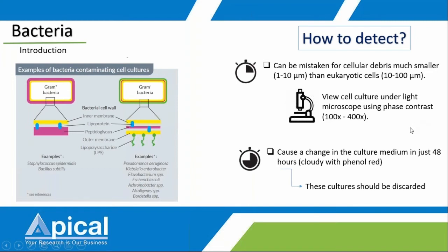So if you are using a phenol-based cell culture media, then you could directly see a color change. Okay, it changes the color to be cloudy. So the moment there's cloudiness in your media, yeah, you have to discard it, right?